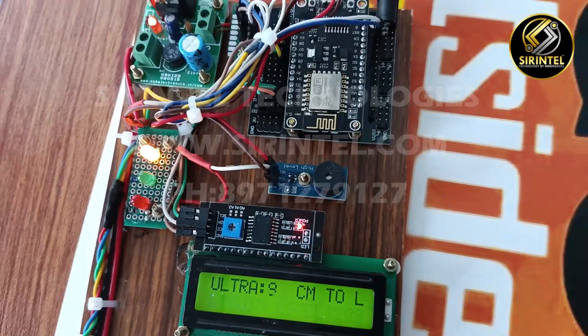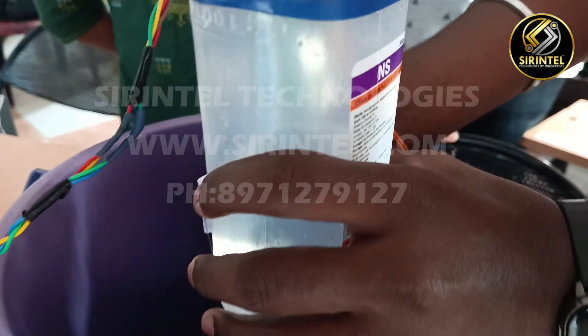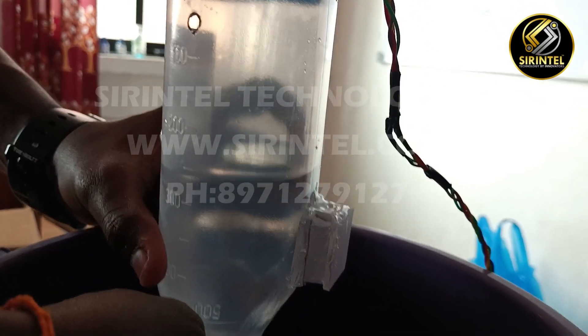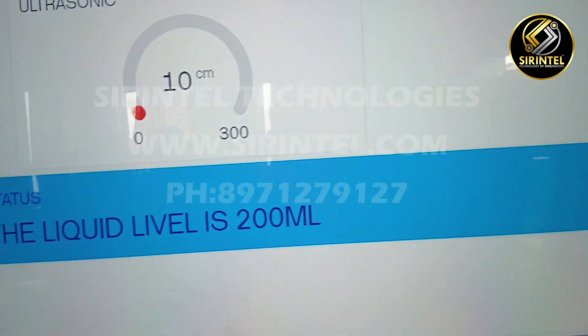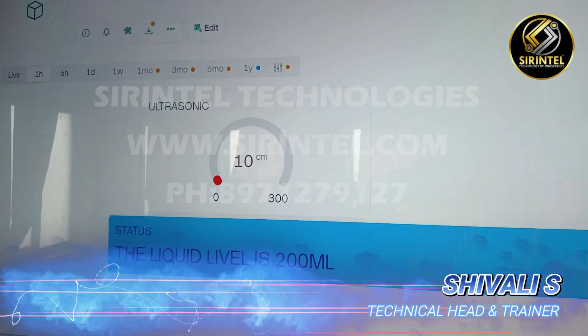This is the IVR bag monitoring project — the drips which are used for patients. Whenever there is a reduction in a certain ml level, it will automatically display on the LCD and also on the IoT. As you can see on the TV, we are showing the IoT reading, and we can also monitor it on mobile.